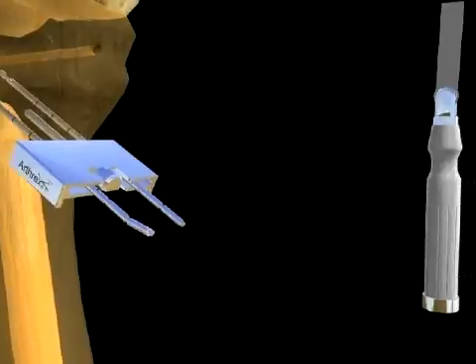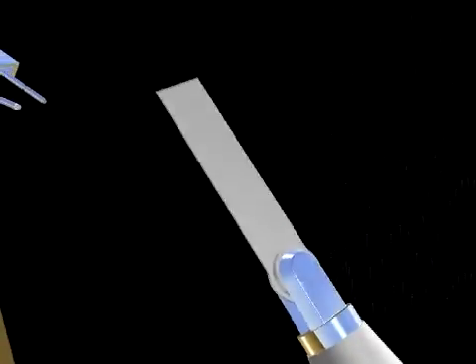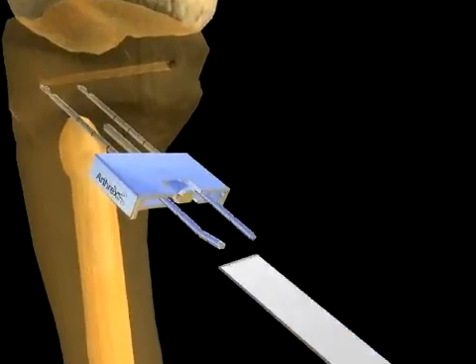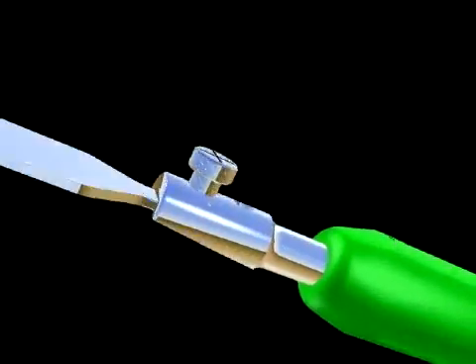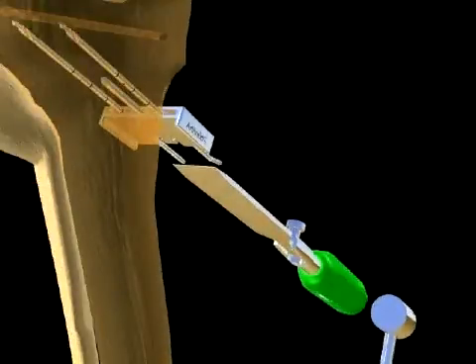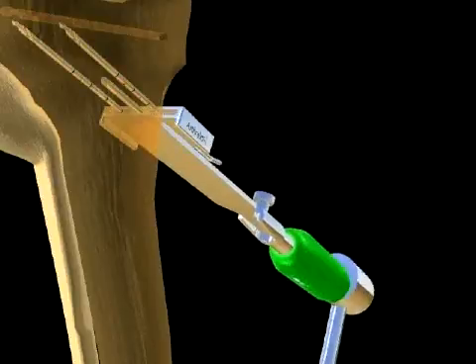An oscillating saw positioned on the inferior surface of the cutting guide is used to resect the tibial cortex medially, anteriorly, and posteriorly. Osteotome blades, available in 10, 25, and 35 mm widths, are assembled on the handle as shown and are used to complete the osteotomy. The osteotomes have depth markings on the blades. Fluoroscopic confirmation should be checked repeatedly throughout the cutting process.